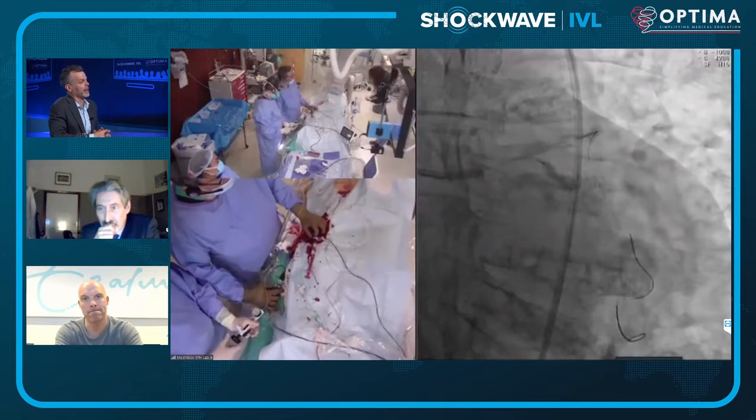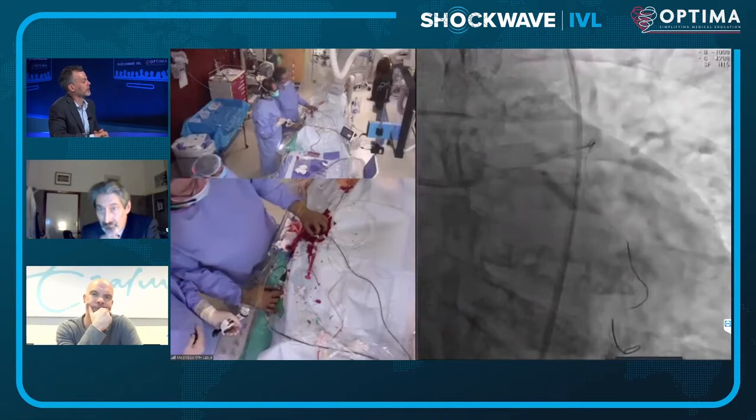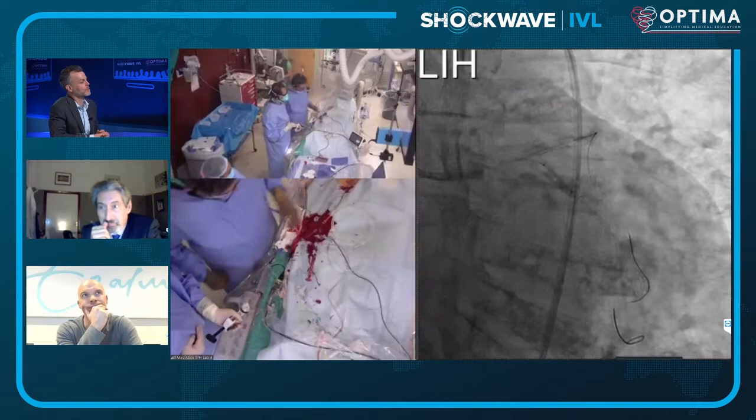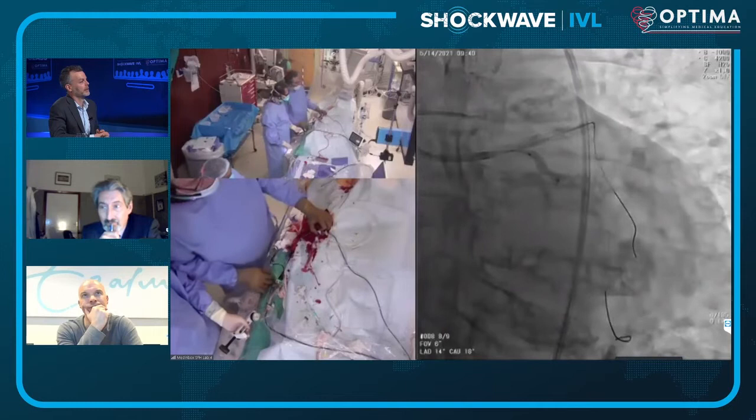Richard reports live: the second shockwave run of 20 pulses in the mid-circumflex — the vessel popped. You can see the cavitation bubble and then the pop. They've done over 100 shockwave cases at St Francis, all with imaging before, during, and after shockwave and stent — three OCT runs per case. The question being investigated is: how do you know when you're done with shockwave? Unlike orbital atherectomy and CSI where you know by feel and sound, here they always image before stenting to confirm fracture and expansion.